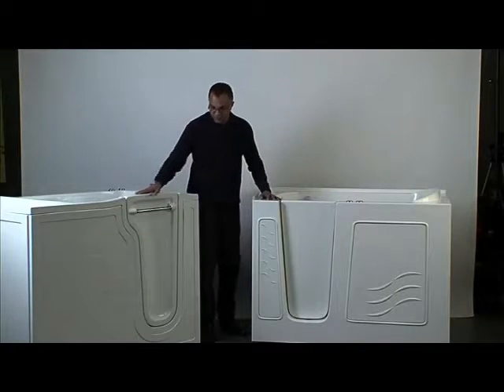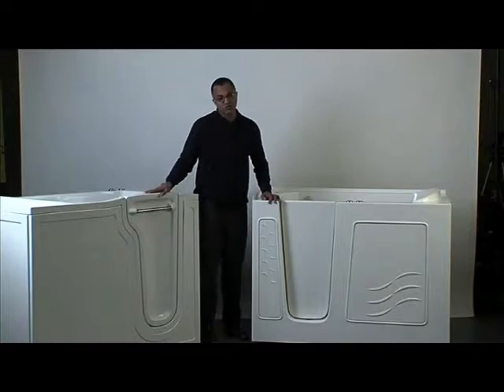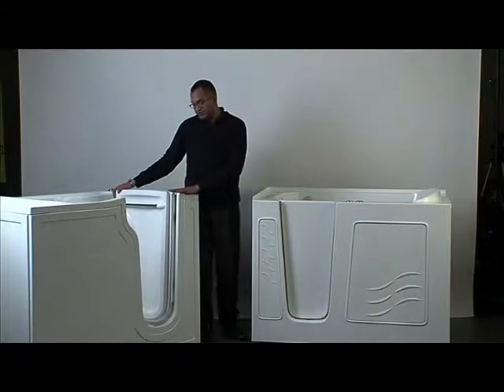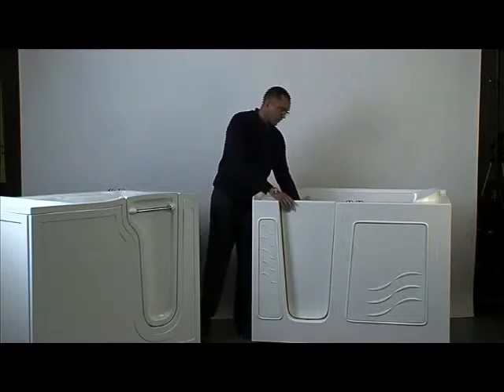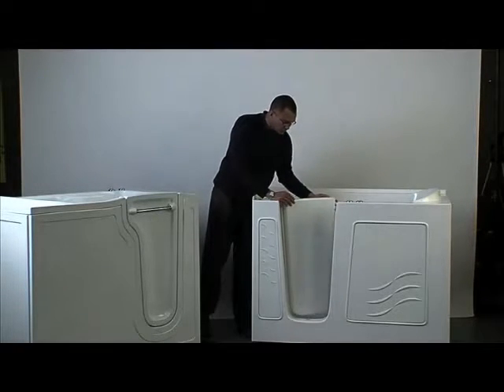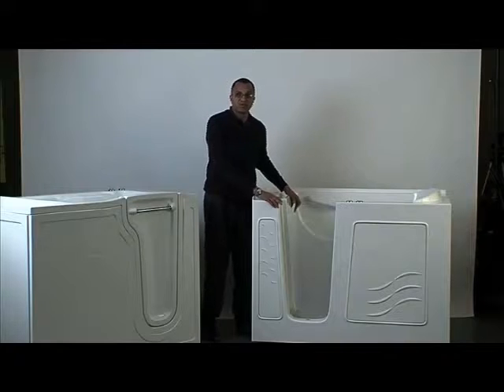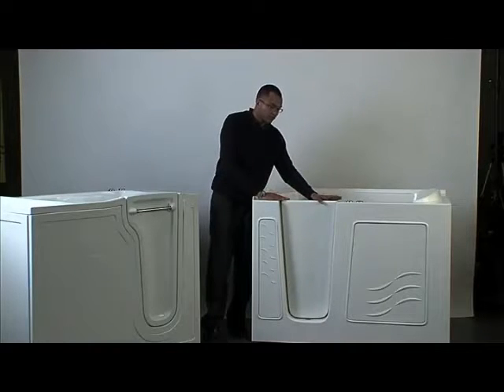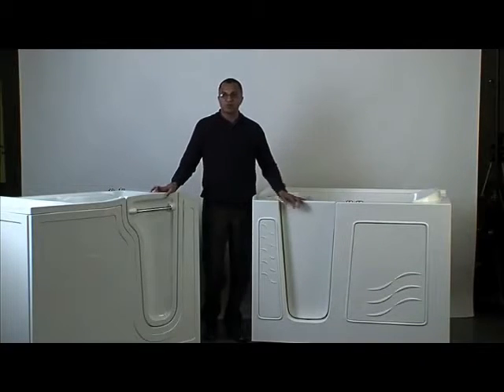Now let's take a look at the doors, particularly the top of the doors. With the Restore, we have a contoured door, which is great because it allows you more space to enter the unit, and once you've sat in it, you have more space to clear your knees when you close it. The Meditub door is pretty much straight up and down with a slight angle — you don't have that additional space. The Restore is 17 inches across the top; the Meditub is about 15. You don't have the same knee clearance, and that makes quite a difference, especially for people with longer legs.